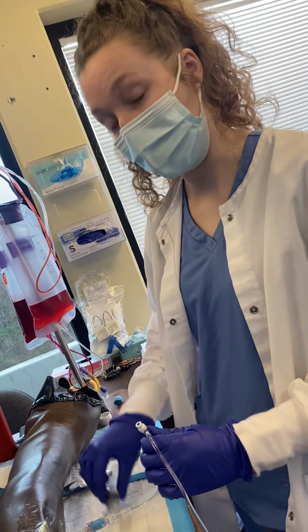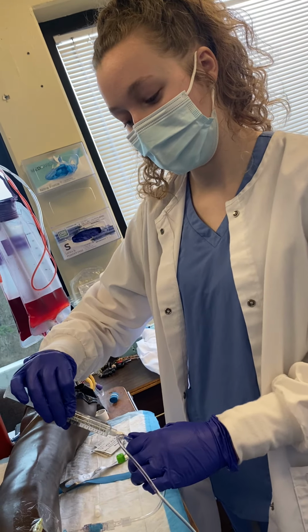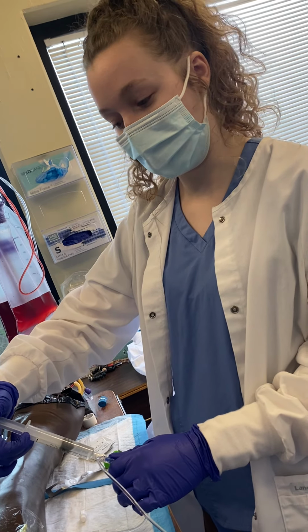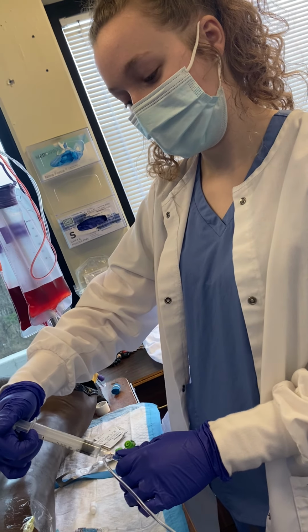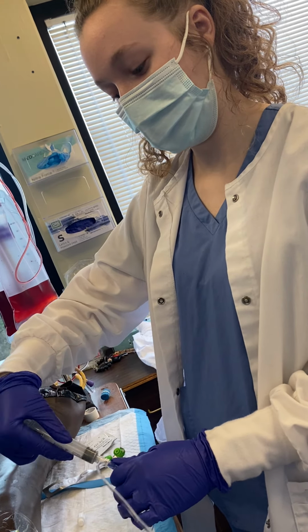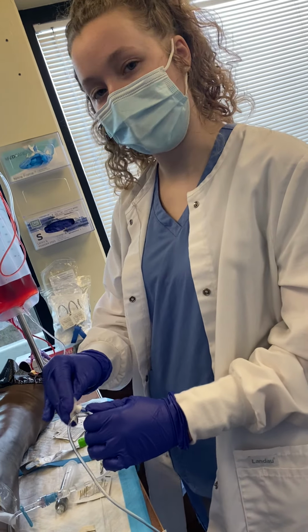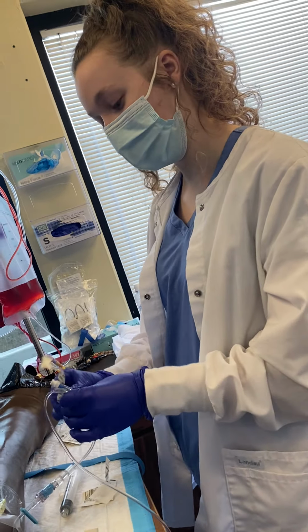And I'm going to take another flush, a separate flush, and attach that to the port and flush my patient's IV the rest of the way. Then I'm going to take another swab and just make sure that it's nice and clean. And then I'm going to take a Caro's cap and attach that to that port.